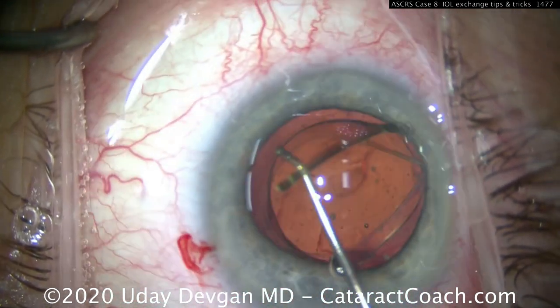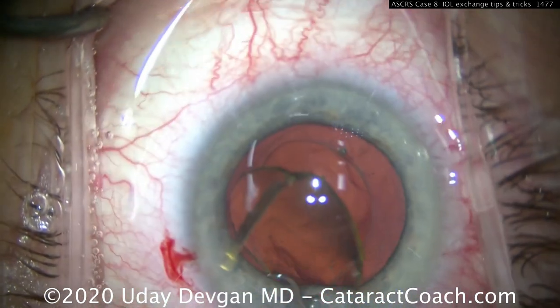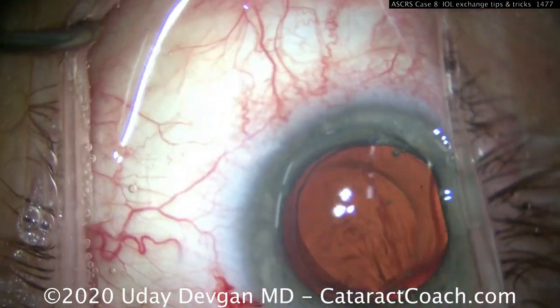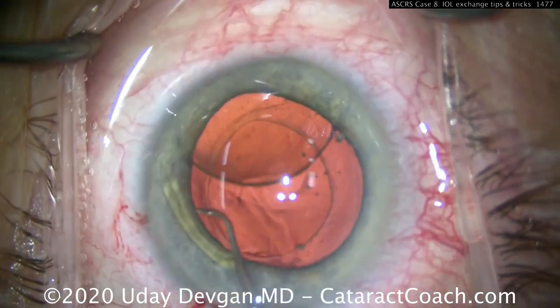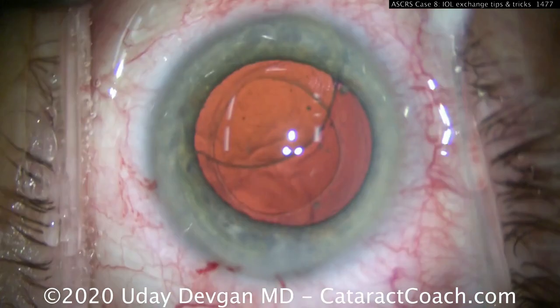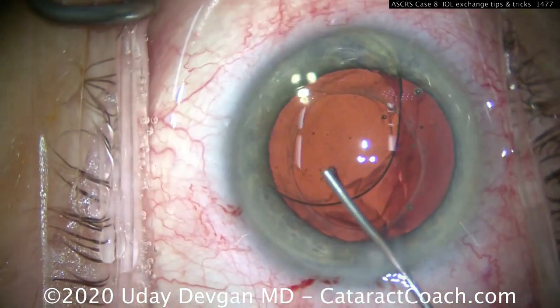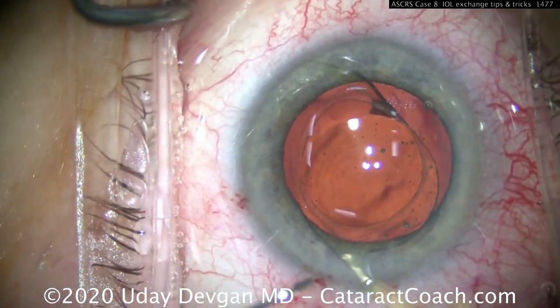Even though the rhexis is on the small side, we'll still be able to get the lens out. If there's resistance — this type of lens has a bulbous tip on the end of the haptic that can get locked into position — you need to spend extra time freeing it up. Once freed, put more viscoelastic under it and then more on top to protect the cornea, and we'll do the twist-and-out technique.